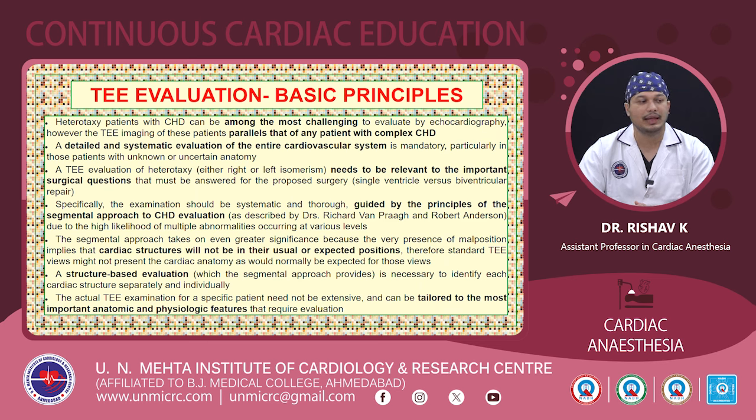So mostly we may have to go for a single ventricle palliation in these patients, but some of the patients may have findings that merit a biventricular repair. So that is one of the important questions that needs to be addressed during TE evaluation. Specifically, the examination should be systematic and thorough, guided by the principles of segmental approach to CHD evaluation. So what is the segmental approach? We will be discussing the segmental approach in the subsequent slides.